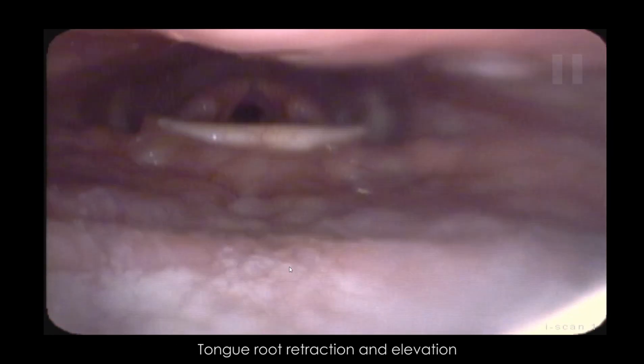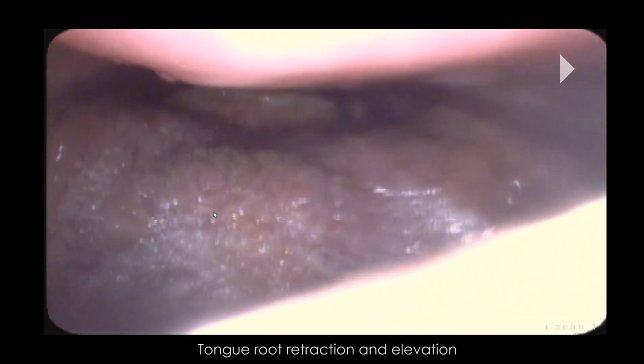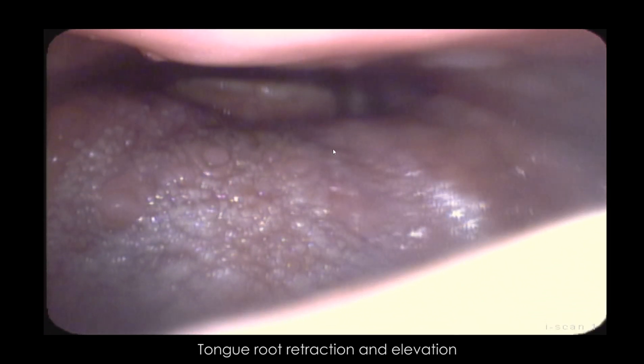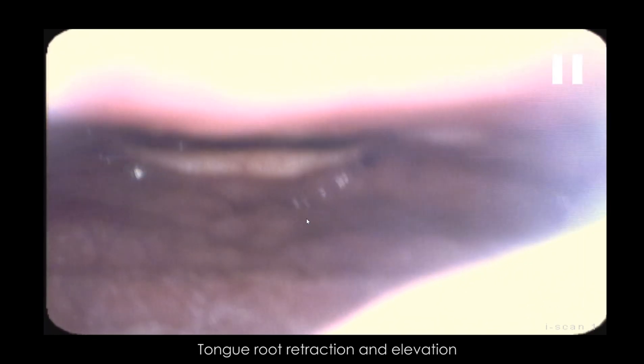I asked him about the tongue root because something that's really important is the structure of the tongue during feminization. I was going to try to do this without raising the larynx too much, and we can actually see some of this — the tongue root retracting back here. We're looking down from the very back of the nose, down the nasopharynx; this is the oropharynx, back here is the pharynx, and down here is the larynx.